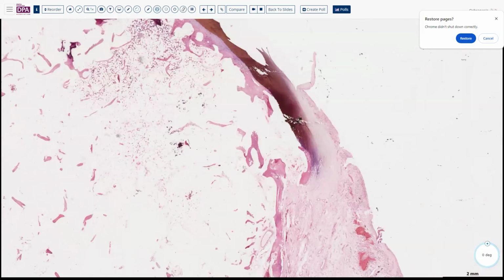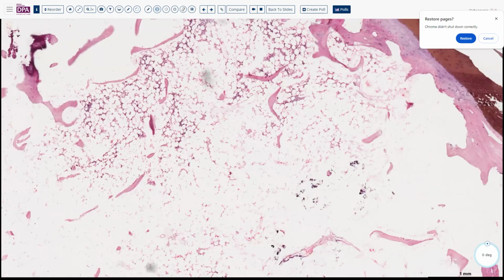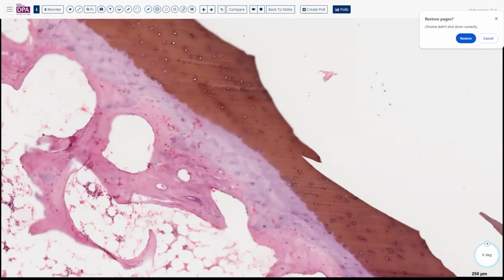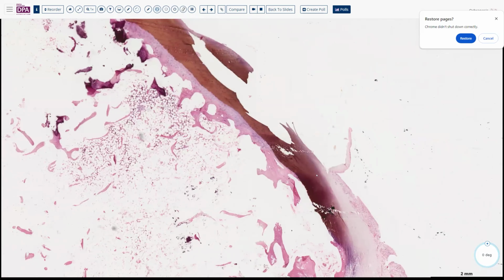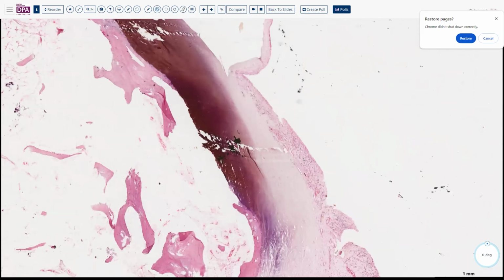So we'll leave aside the issue of osteopenia, and here mostly fatty marrow, a little bit of hematopoietic marrow, and focus on this discoloration here. It's kind of a characteristic brown discoloration. It seems to be more intense towards the surface of the joint space, and not even out here a little further past the synovium, we see it.